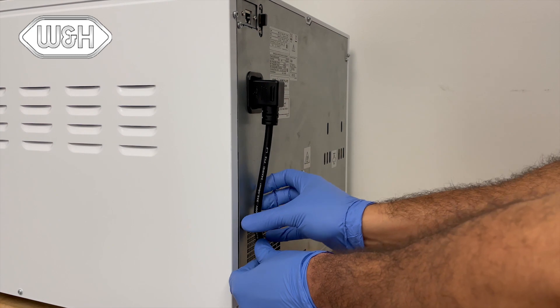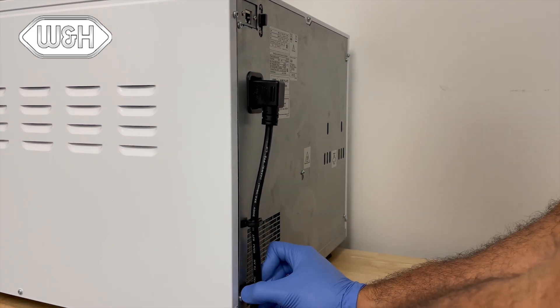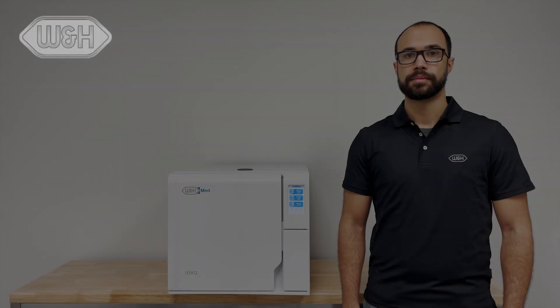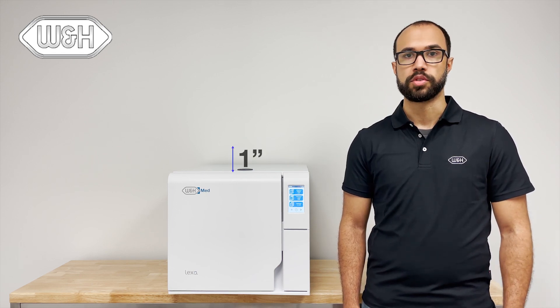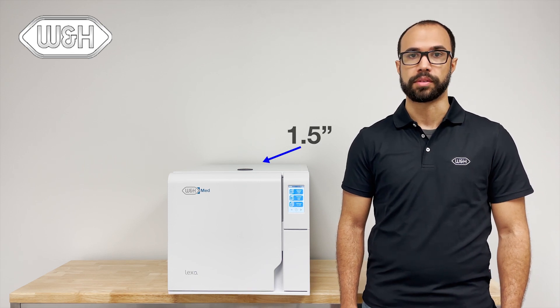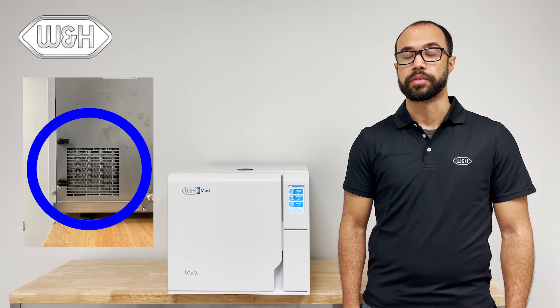Attach the power cord to the rear power socket in the back of the Lexus and wrap the cable through the guides. Once installed, ensure that there is at least an inch and a half on either side, one inch on the top, and an inch and a half in the rear of the Lexus for proper ventilation. Also, make sure that the condenser vent is not covered by any object.